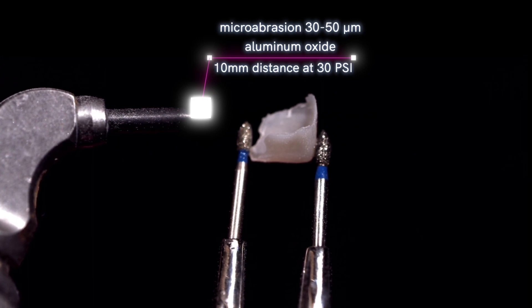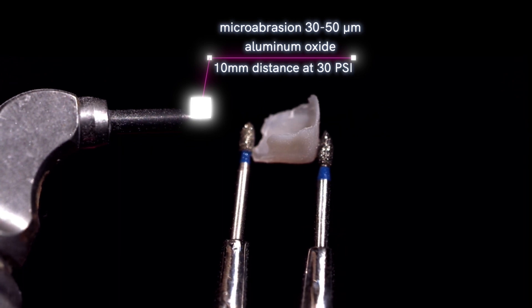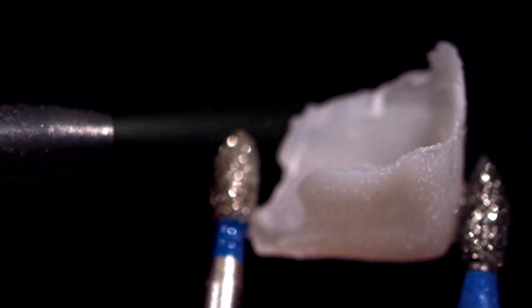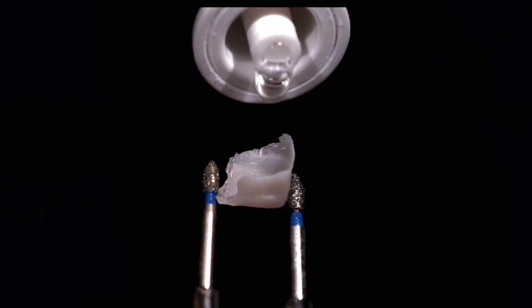First step is microabrasion with 30 to 50 micron aluminum oxide. You do not need CoJet sand. 10 millimeters distance with about 30 psi. You're going to roughen the surface with the air abrasion. Typically, I'm air abrading each prosthetic for about 15 seconds. This is going to make a rough surface.